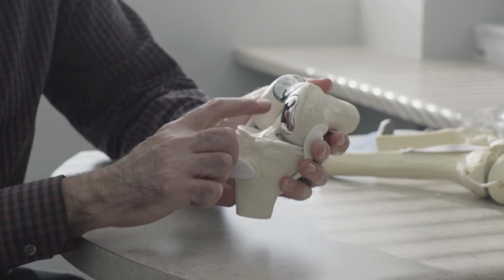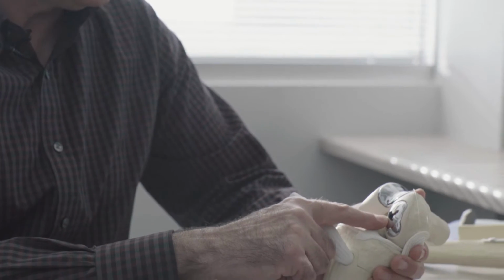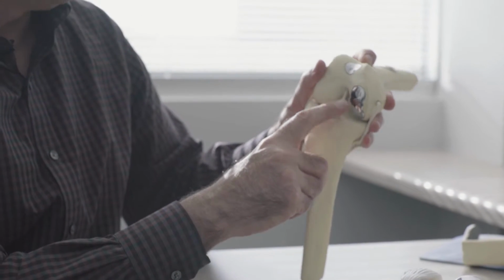Inlay resurfacing, which is the least invasive method, involves putting in metallic inlays, they come in different shapes and different sizes, into the joint surface. I like to think about this and explain this much like repairing a tile on a kitchen floor. Rather than ripping out the whole floor or switching out all the tiles, just replacing the broken tiles. In this instance, we have it on the medial condyle and under the patella. The patella itself can also be resurfaced with an inlay. The inlays come in different shapes and sizes, and for that matter can be done in different joints. And here we see different sizes on the femur.